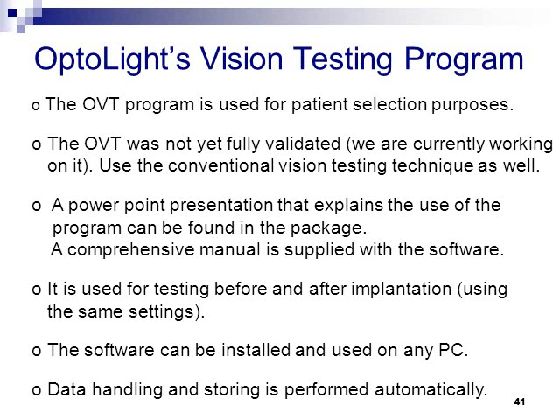The traditional procedure of patient selection for OriLens implantation may be time-consuming. Optolite designed this program in order to find a way to facilitate the patient selection process and, even more important, to standardize the testing results. The goal of this program is not to find the exact maximal BCVA with and without the use of an external telescope. It is designed to demonstrate whether a certain predetermined improvement in visual performance post-op may be achieved compared to pre-op vision without the telescope. This will enable us to decide whether or not a patient is a good candidate for implantation.